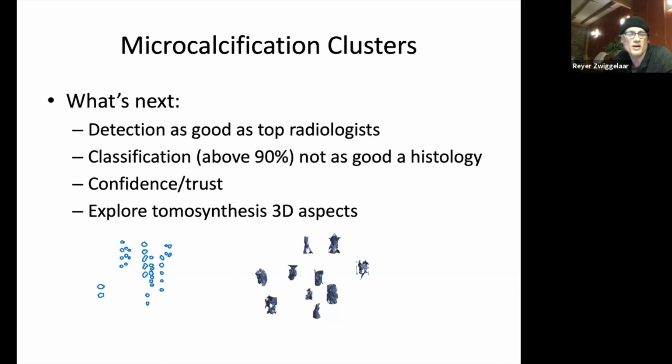We are looking at to what extent you trust this and what kind of confidence levels we actually need in that. In addition, over the last couple of years, we've been exploring tomosynthesis, 3D aspects. Tomosynthesis is effectively a 3D version of mammography, and we can model the microcalcification clusters in 3D now, see how they are connected in 3D as well, and extract interesting features in that space and see how that can be used for classification results.